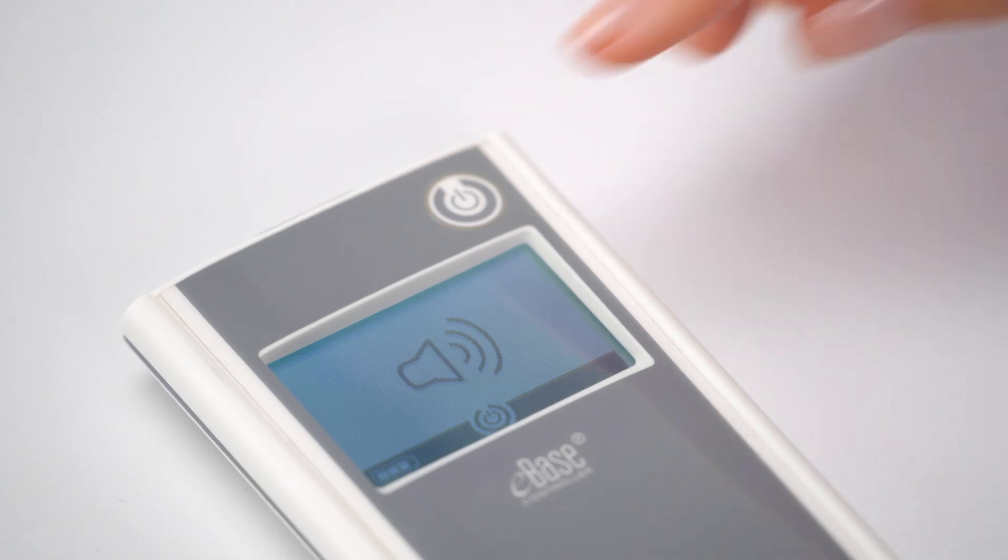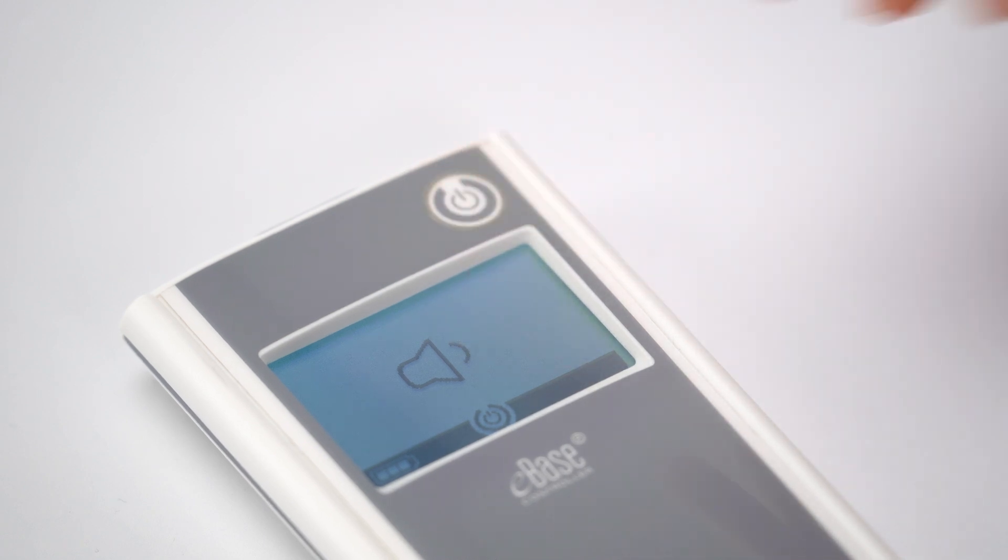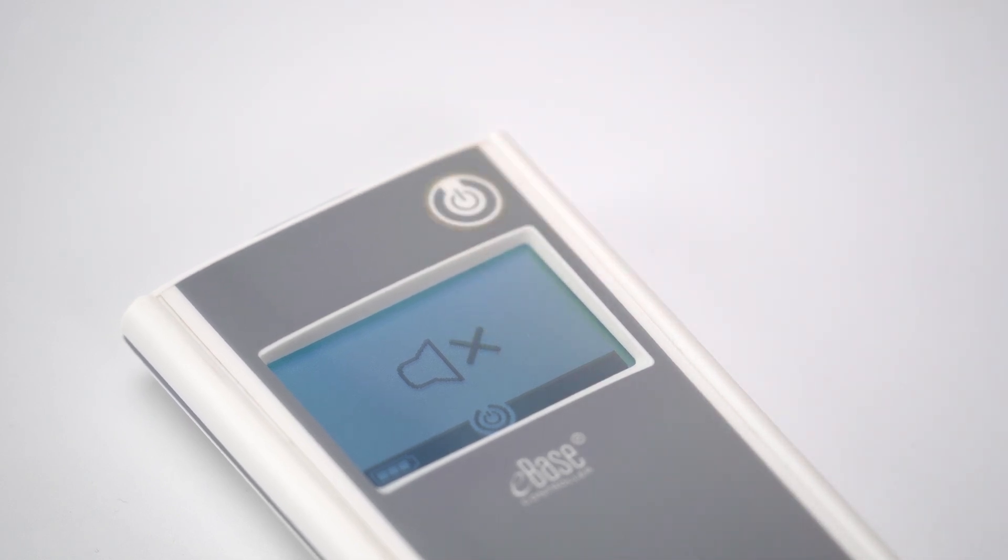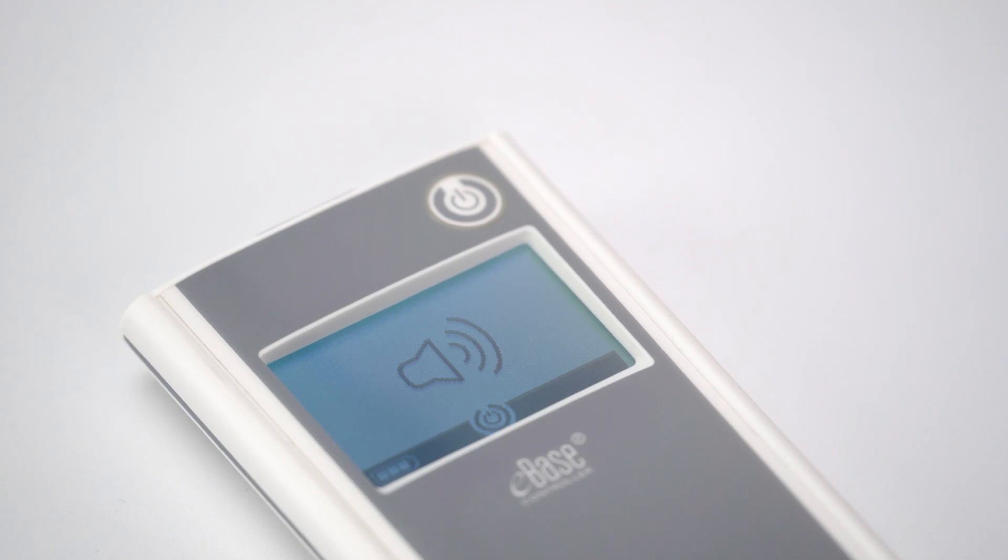In the first step you can change the volume of the beeps. By repeatedly pressing the on-off button, choose between the option default with two beeps as acoustic status feedback, and the options all signal tones off, and reduced signal tones with one single beep. The controller automatically saves the selection after a few seconds.